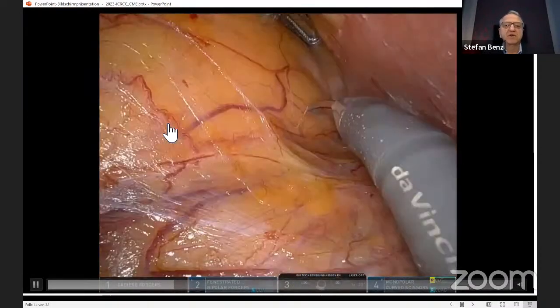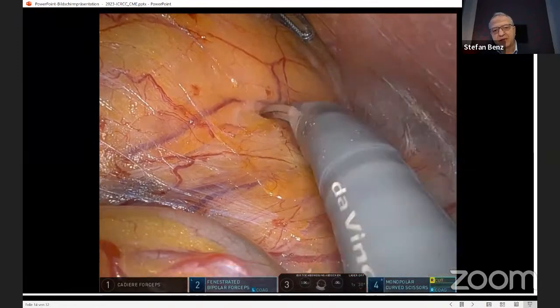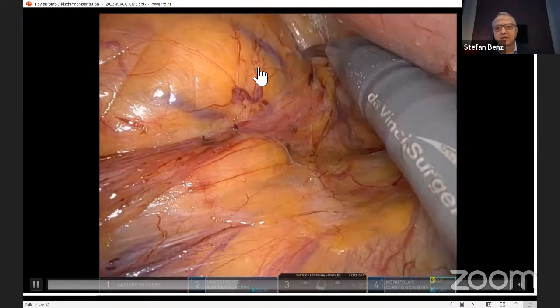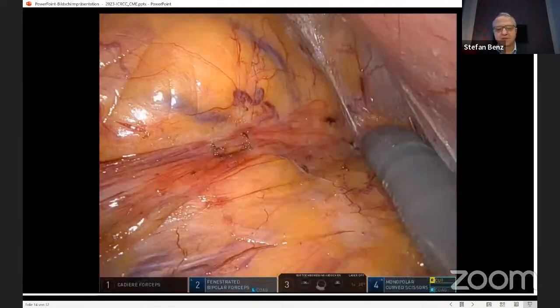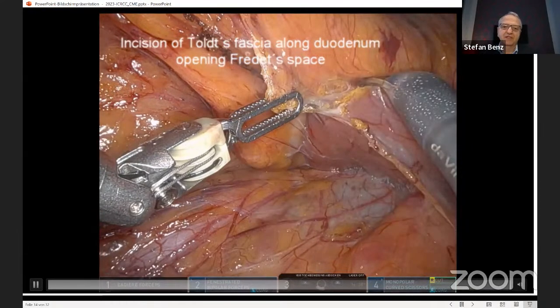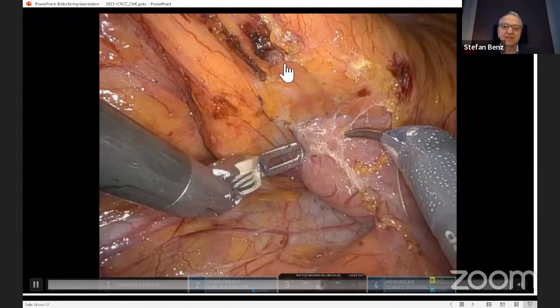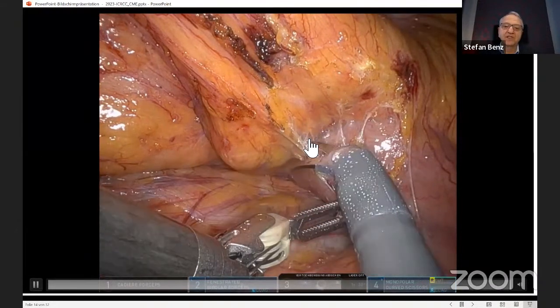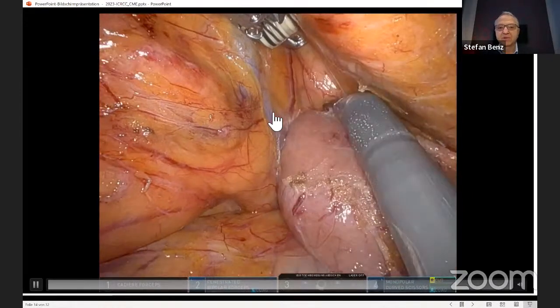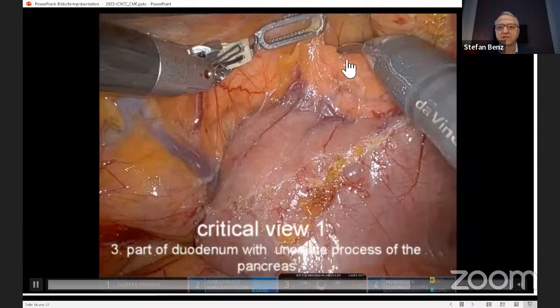Okay, we push down the anterior renal fascia. That's the anterior renal fascia, which is being pushed down. The parietal peritoneum is that smooth surface here. And this is done, as you see here, until you reach the hepatic flexure. Now, Toldt's fascia, which is the parietal peritoneum, is incised to reach the anterior surface of the pancreas here. You see the superior right colic vein here, pancreas here, and now we just dissect the anterior surface of the pancreas.